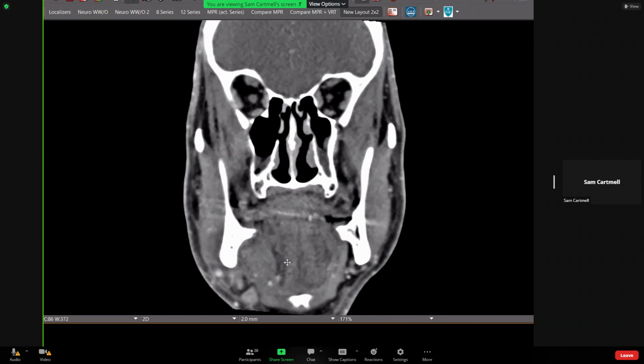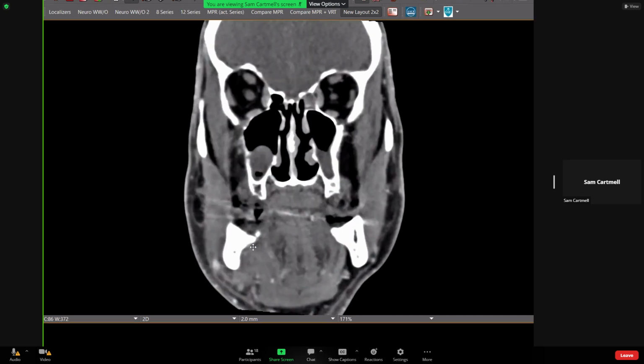So we have axial and coronal contrast enhanced CT. I think symmetry is always helpful. So if we're looking at the right side here, I want you to consider what space we might be looking at. It looks asymmetric, right? Fat is your friend. This fat looks very clean on the left side. There's not any stranding or edema within it. But if we look at the other side, here's the platysma muscle, by the way. That's technically the most superficial layer of the cervical fascia.